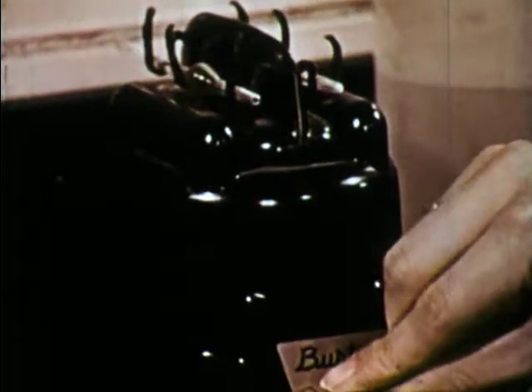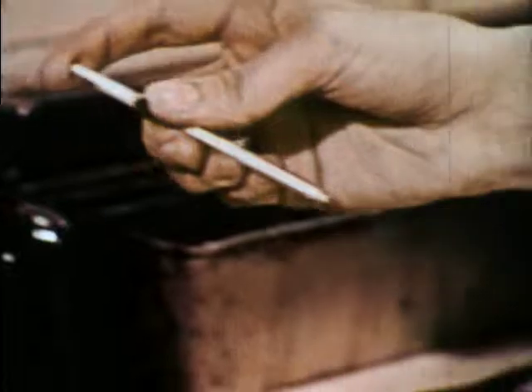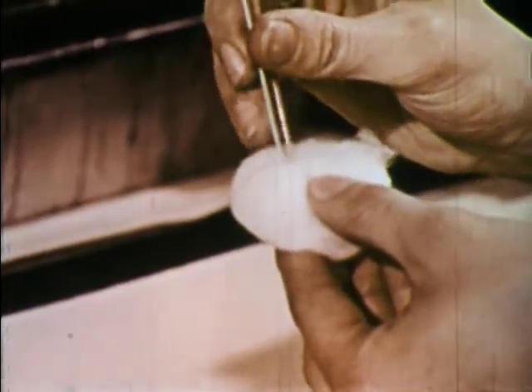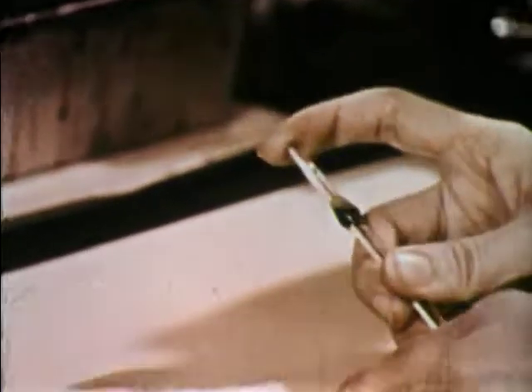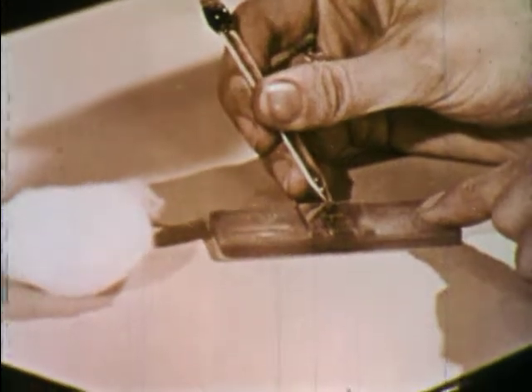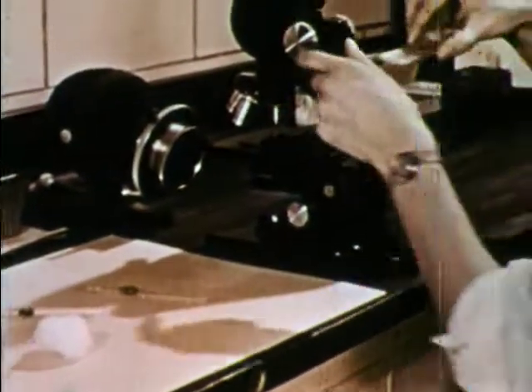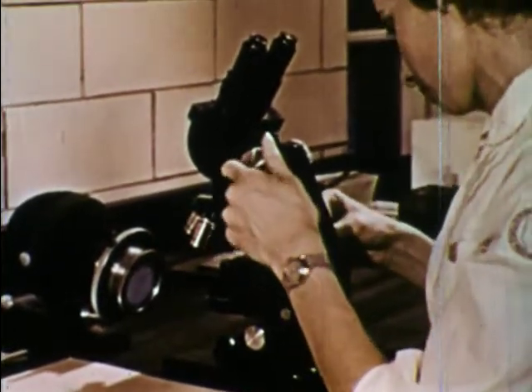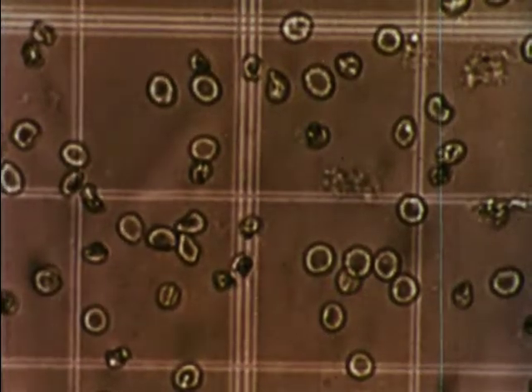By mixing blood with an exact proportion of a special fluid, in order to dilute it, we can estimate the number of red corpuscles. This is a common test which gives important information about a person's state of health. A small amount of diluted blood is placed on a ruled microscope slide. The technician determines the number of red cells per cubic millimeter by finding the average number in the measured spaces of the slide.